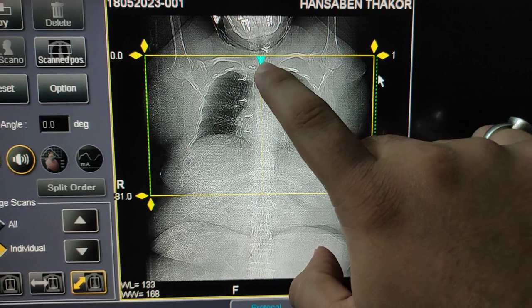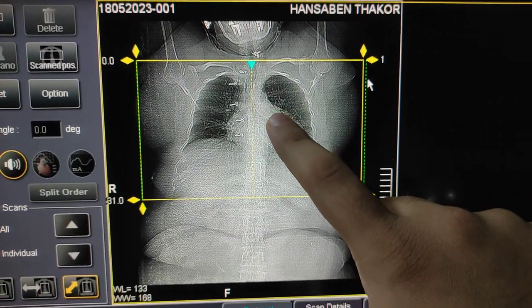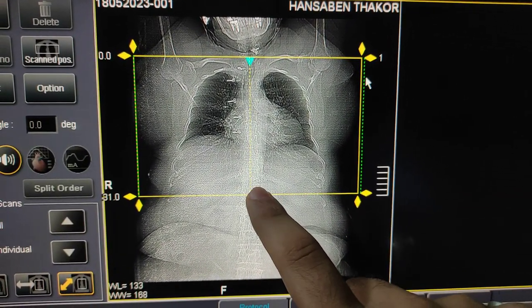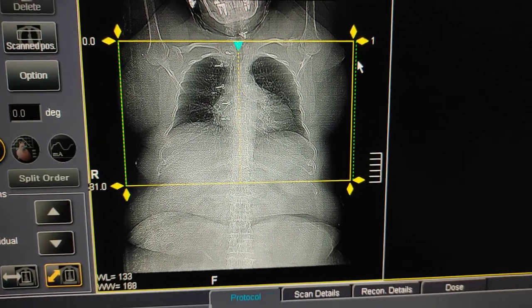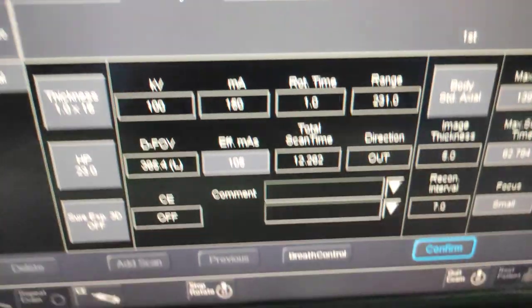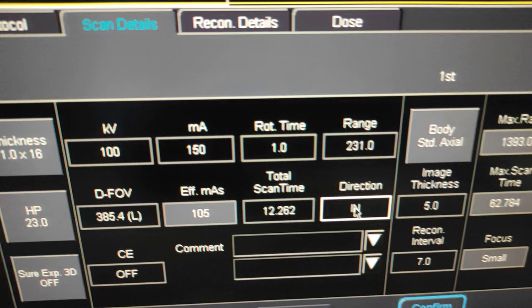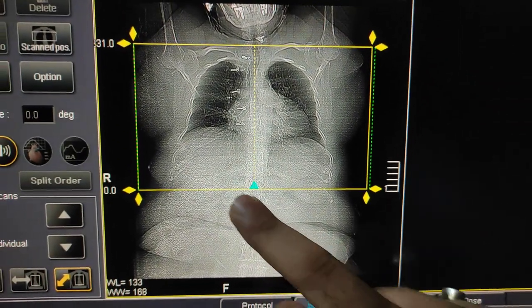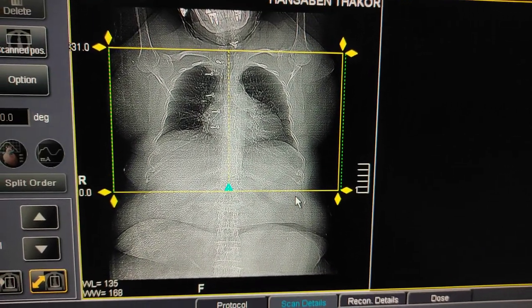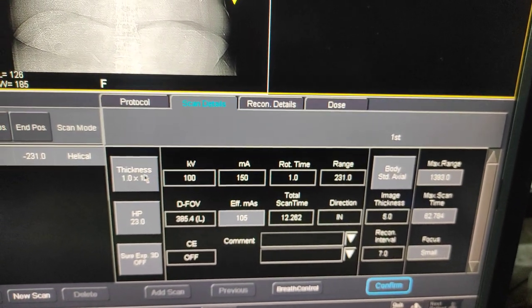See the indication — this small arrow shows the scan is going to start from apex to diaphragm. But this patient is aged and may not hold their breath properly, so I will change the direction. Now the arrow is repositioned, and this is the area you have to cover.